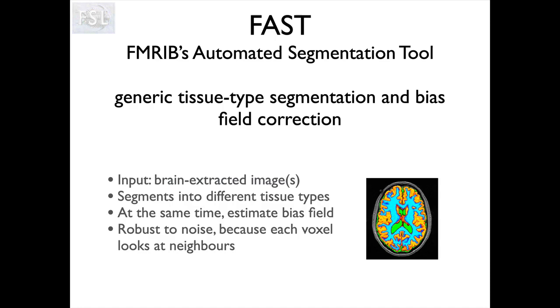My name is Mark Jenkinson, and in this video I'll be talking about a tool that we have for segmenting tissue types within the brain. That is for delineating where the different tissues are.